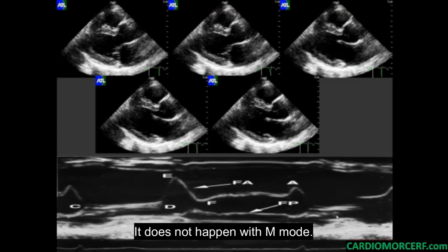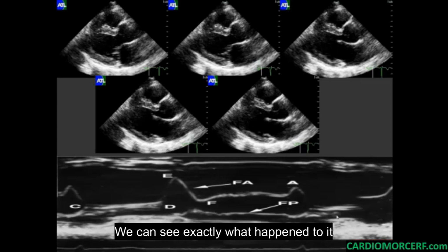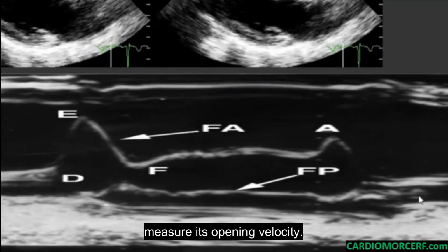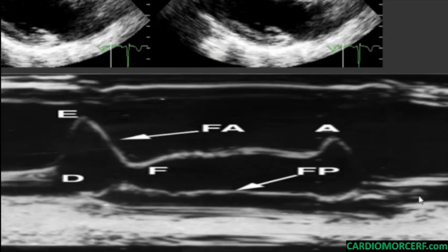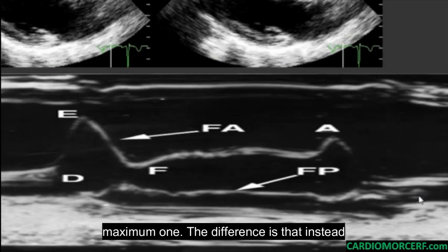It does not happen with M mode. Look at the mitral valve. We can see exactly what happened to it during the whole cycle. No jumping. We can see it opening and even measure its opening velocity. This maximal approach to the IVS is the maximal one.